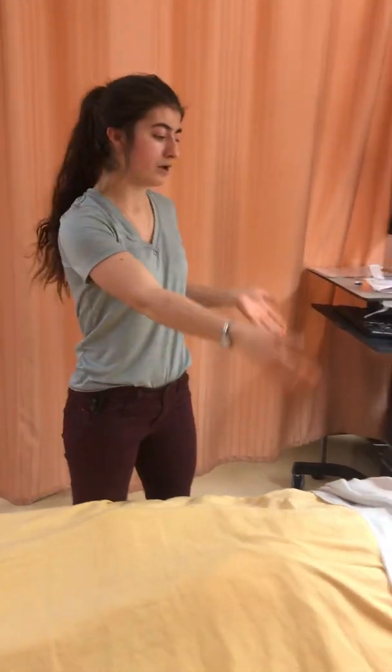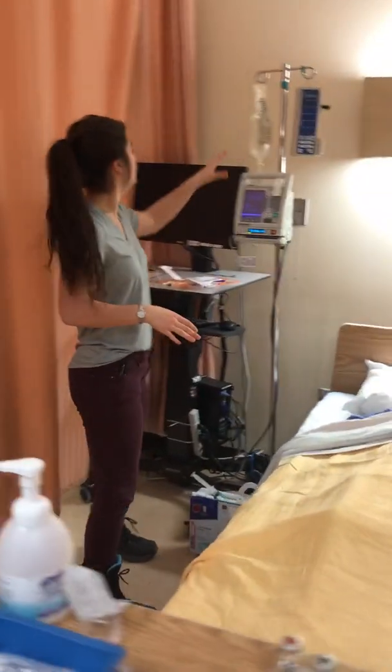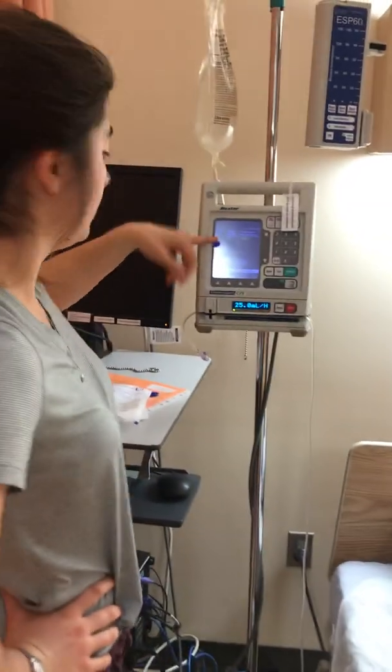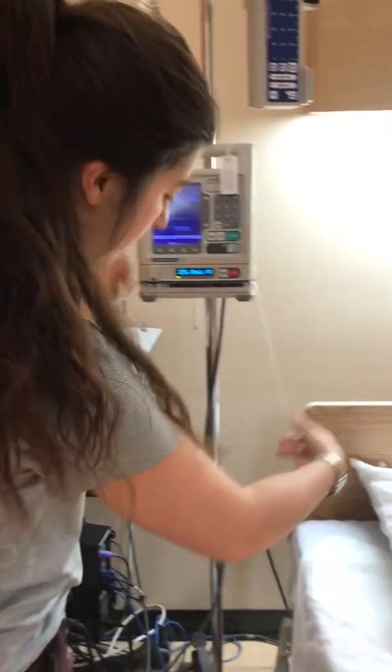The bed is down, the side rails would be raised unless they're okay with that. I'm going to check the IV line. They have their normal saline hanging. It's hanging at the correct rate. There are drips going in the drip chamber. There are no occlusions.